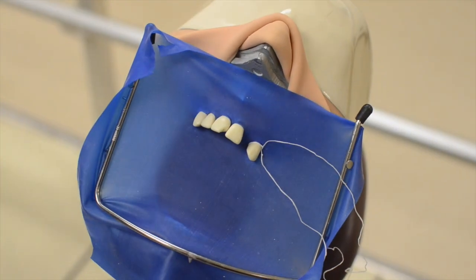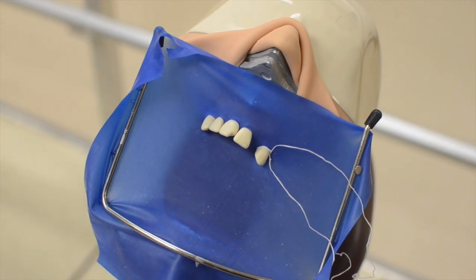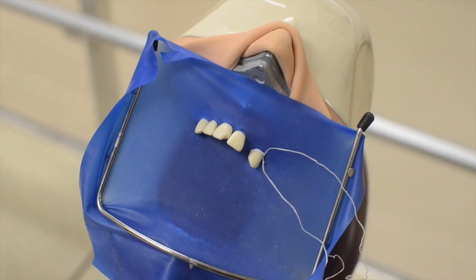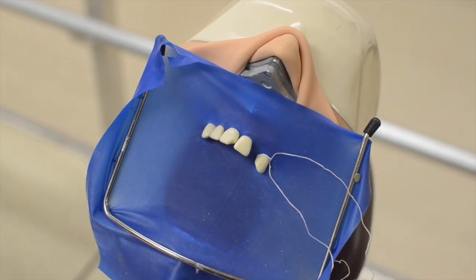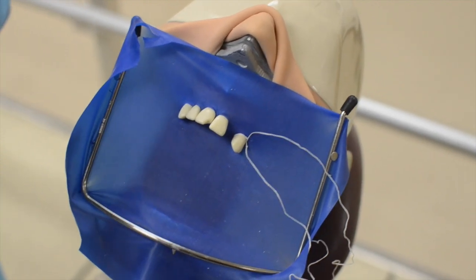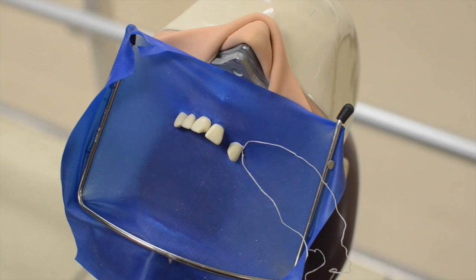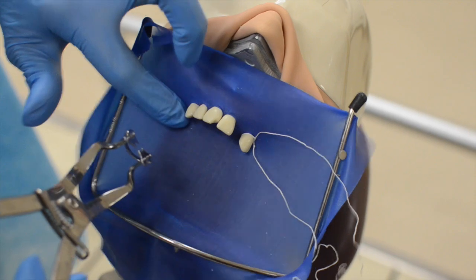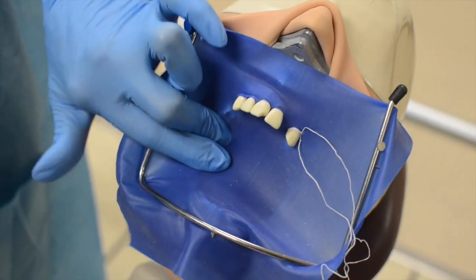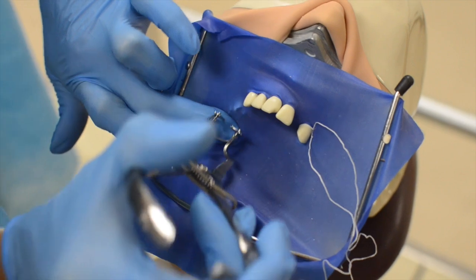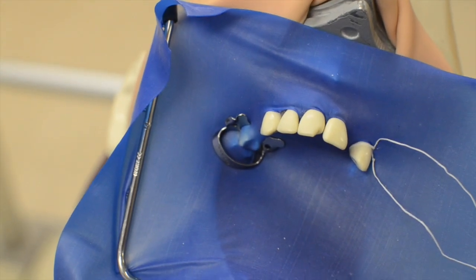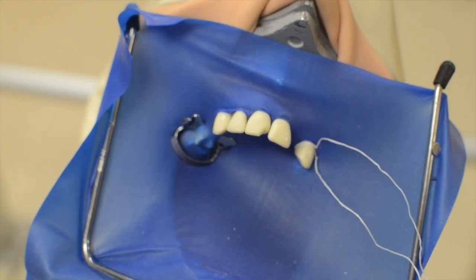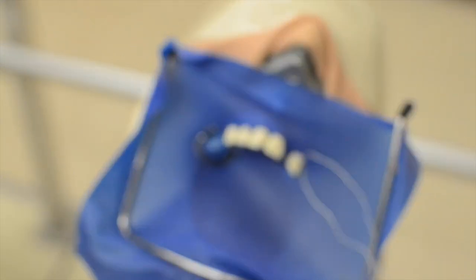Suppose you were in the clinic, and you had done this, and midway through the procedure, for whatever reason, the rubber dam starts slipping off. Look what you can do. After the fact, we're going to attach a clamp. Let's say it starts slipping off of this cuspid. We certainly don't want to disassemble everything. Well, we don't need to. Look what we can do. There you go. Problem solved. Right now, we have a bigger problem. We dropped our equipment.